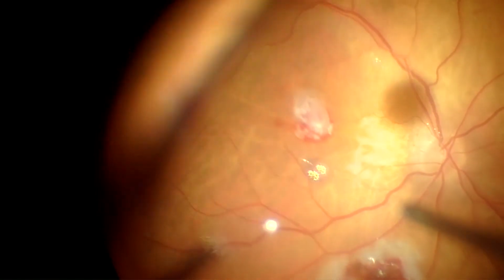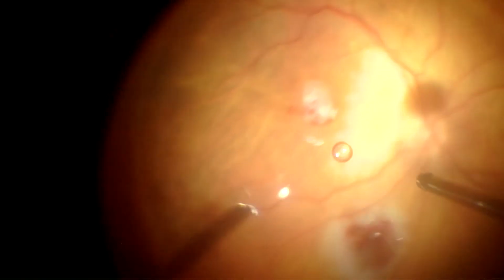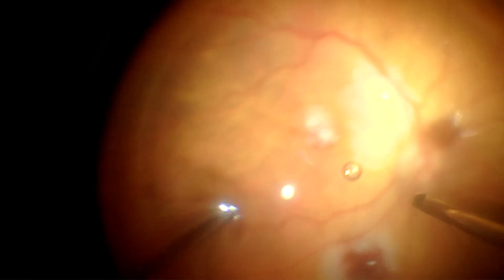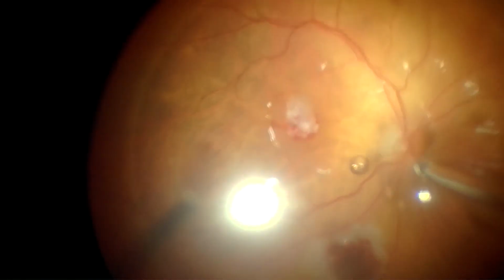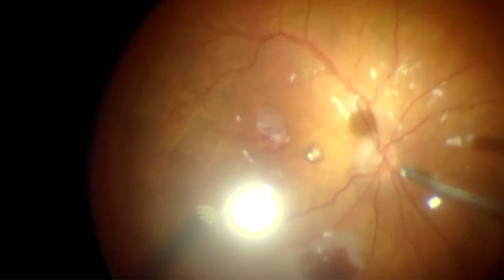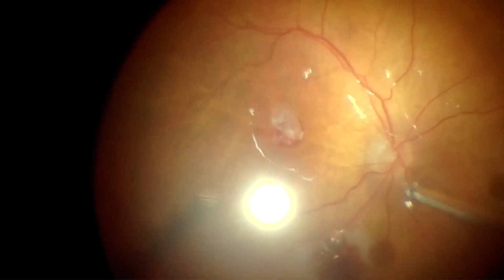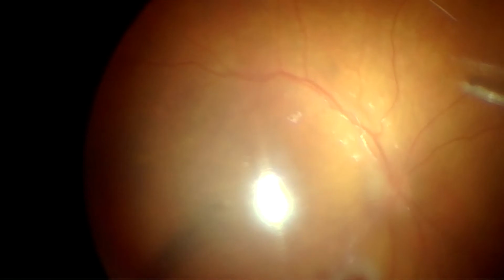We are now removing perfluorocarbon liquid. Air is coming in. The point now, in order to avoid the displacement of the graft, the best thing to do is to remove all the water that is present inside the eye. So what we can do, we can now remove perfluorocarbon liquid, but we can leave a bubble around. Now there is air, perfluorocarbon liquid. Have you seen that I was removing fluid?